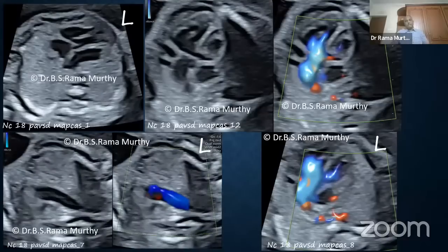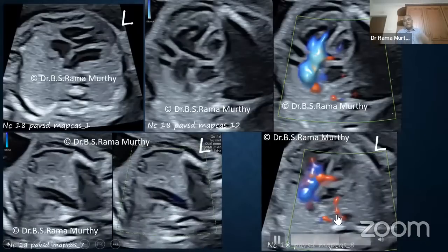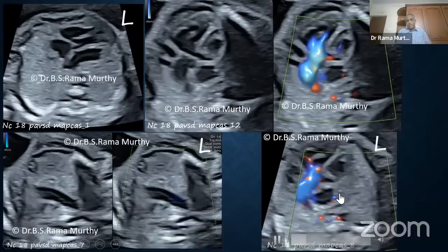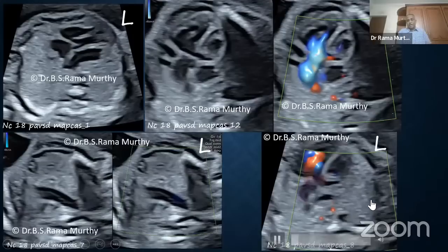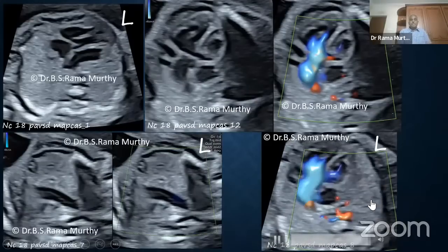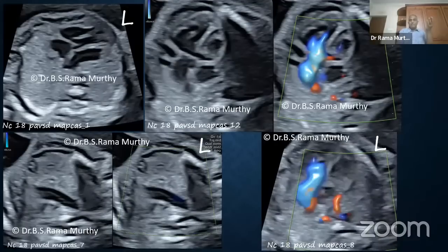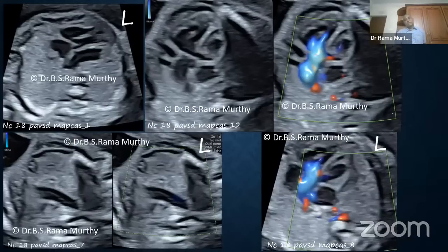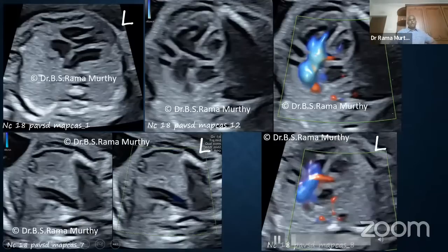Scale. And when I begin to look for collaterals using a lesser PRF, I find that the collaterals are coming from the descending aorta. You can see that here. So here the pulmonary supply is from the descending aorta, and that becomes a type C, which is MAPCAs, pulmonary atresia with MAPCAs, major aortopulmonary collaterals. And this has a worse prognosis. The one with the MAPCAs has a worse prognosis compared to the one which has a ductus-dependent reverse arterial flow.